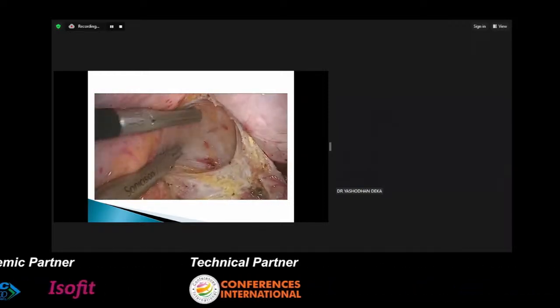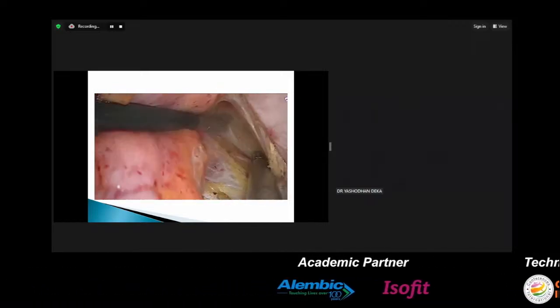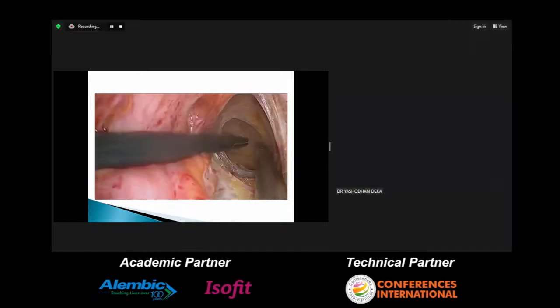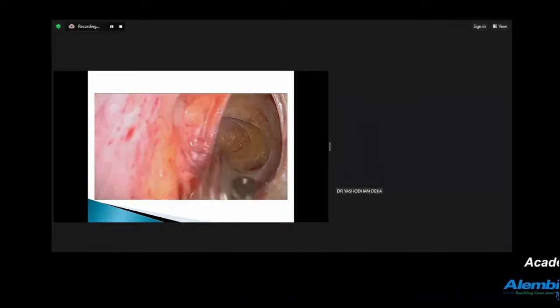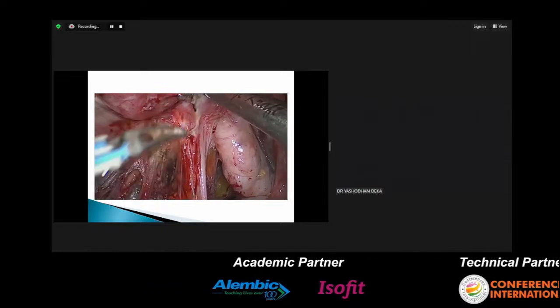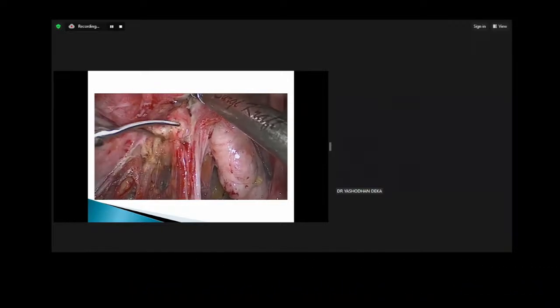The ovaries and the uterus might look normal. So then you develop... I call this a push, open, push technique. Just push, open, and push, open, and push. Somebody has named it the POP technique. It's very interesting.